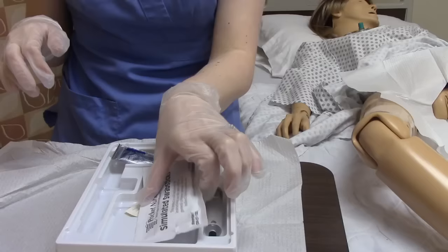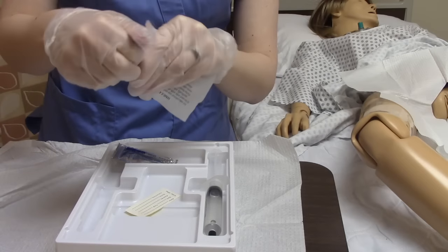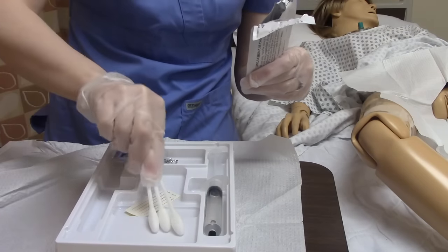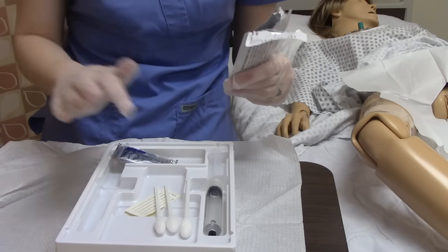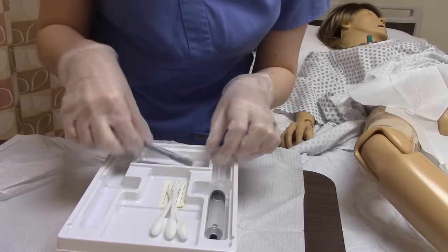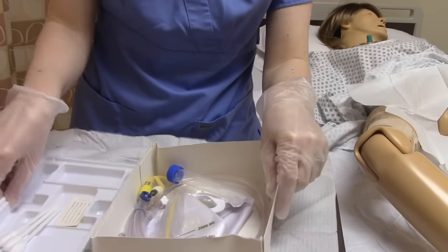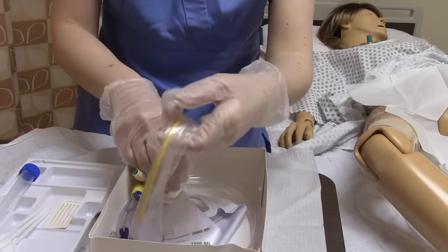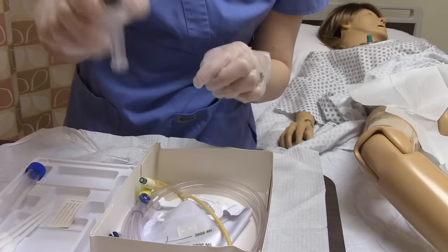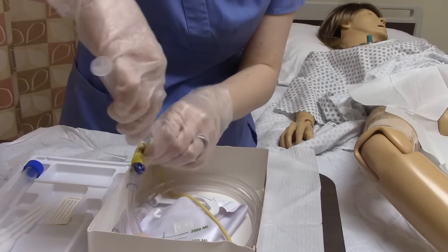Now we're going to prepare all of our things. We're going to open our swab sticks — these are our betadine swabs. You want to make sure you're asking your patient if they're allergic to shellfish or to latex when you do a Foley catheter. We have non-latex catheters and chlorhexidine as alternatives to betadine swabs. We'll open our lubricant and then get our catheter prepared.